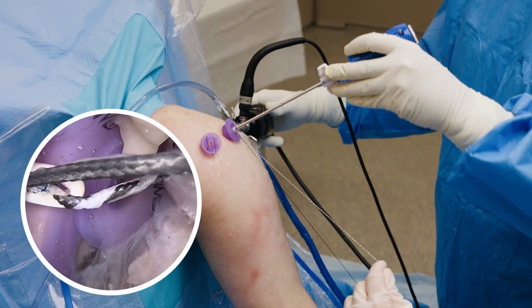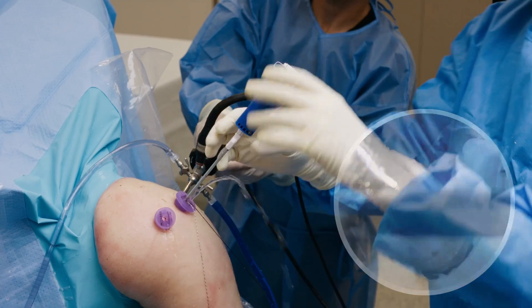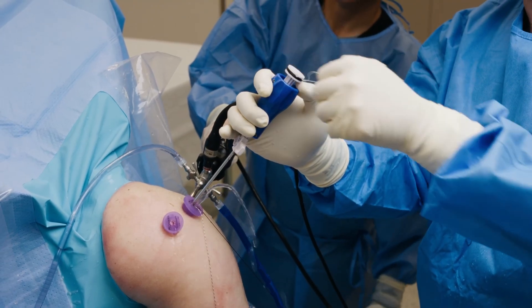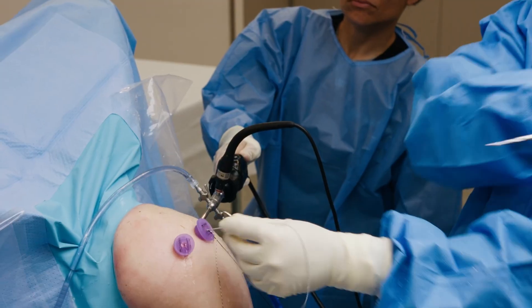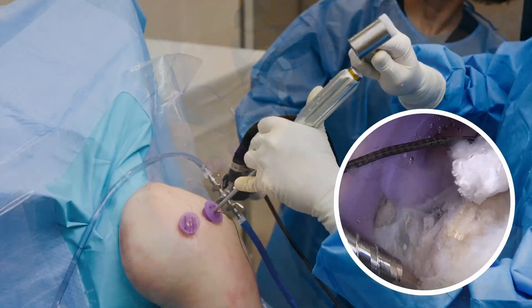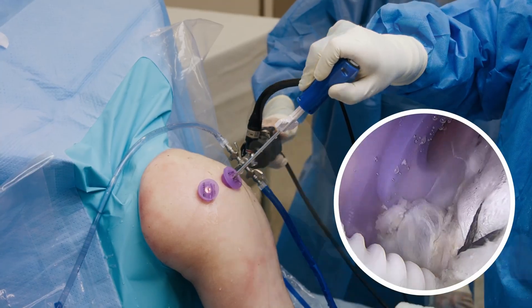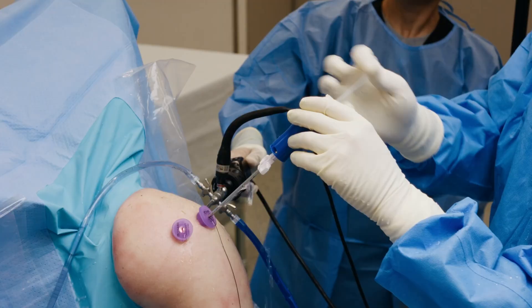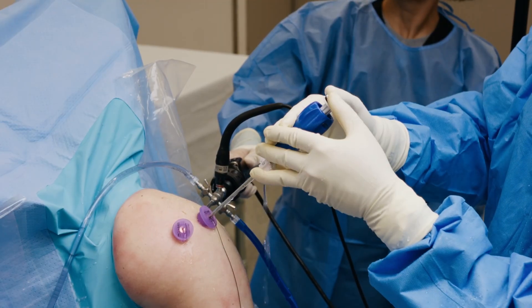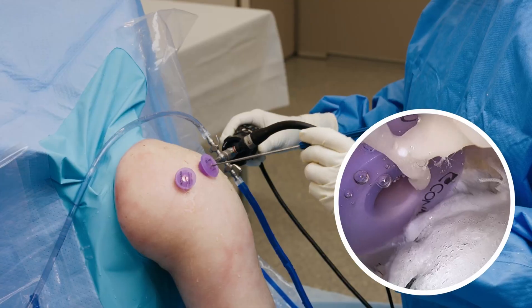You can see in this arthroscopic image that we're placing the Argo Genesis anchor in the anterior location with that black-white suture. This gives us excellent, quick, and efficient fixation of the biobrace device. We're now moving to the posterior location where we'll tap and then place the anchor in this location to complete our biobrace augmentation. The biobrace RC makes this a very quick and efficient process for surgeons that want tissue augmentation for their rotator cuff repairs.